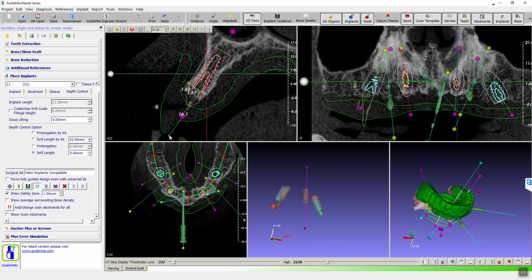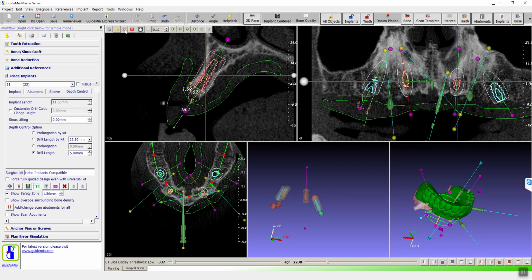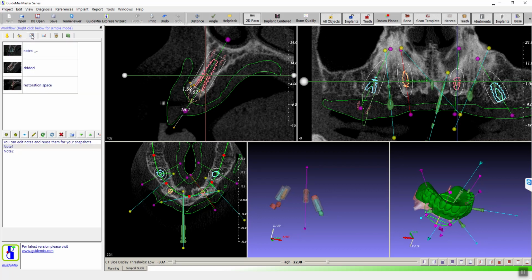So after we capture the dimension, we capture this image, and we tell the technicians whatever we want to tell them. So all those pictures and the dimensions and other pictures will get into the report. They are here. So those are the pictures we captured.